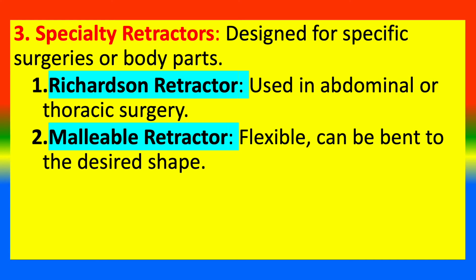Third type, specialty retractors, designed for specific surgeries or body parts. It's classified into two. 1. Richardson retractor, used in abdominal or thoracic surgery. 2. Malleable retractor, flexible, can be bent to the desired shape.